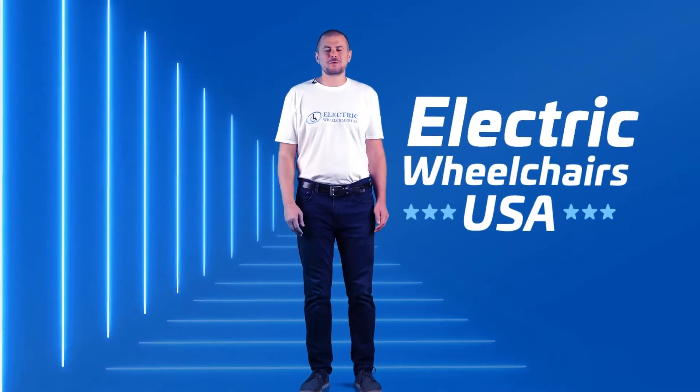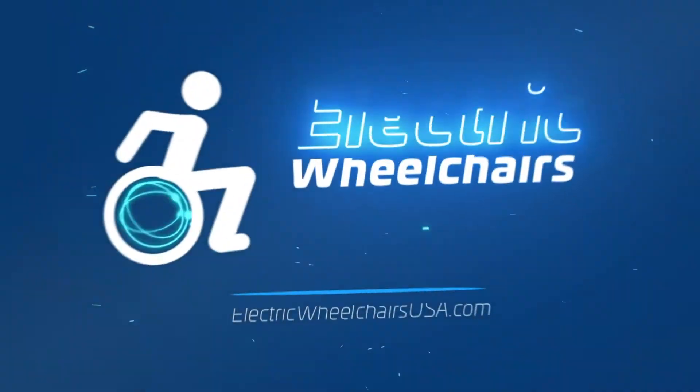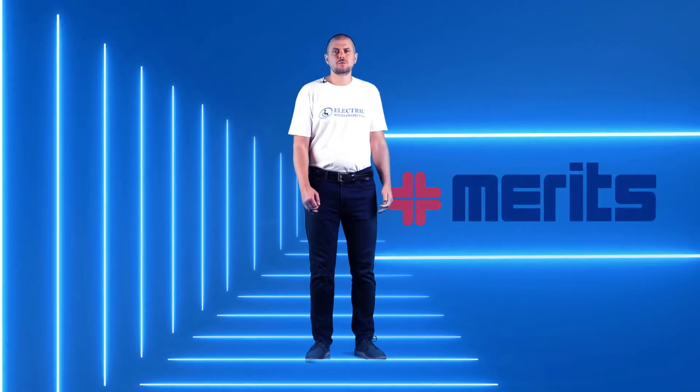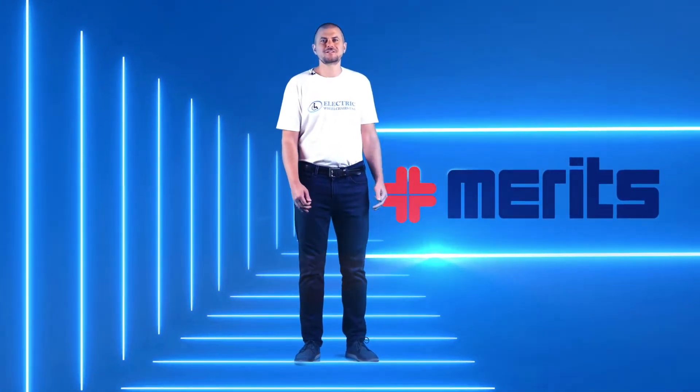Hi, welcome to the Electric Wheelchairs USA YouTube channel. In this video we're going to give you a quick overview of the Pioneer by Merits Health Products. We went to their headquarters to take a closer look. Let's check it out.